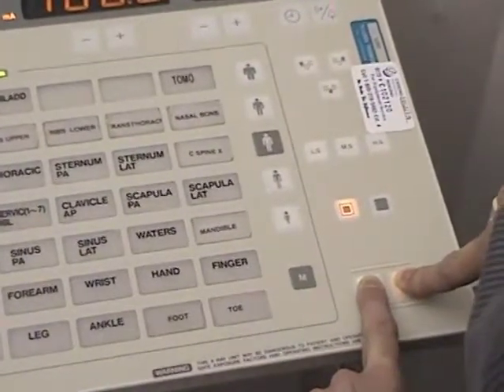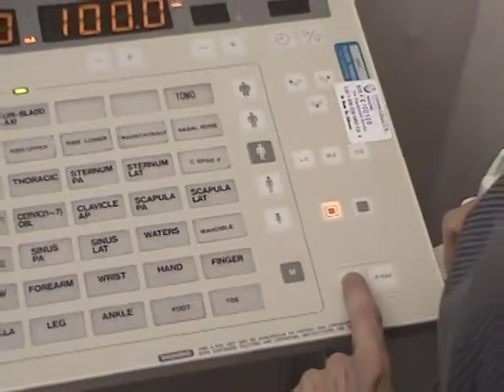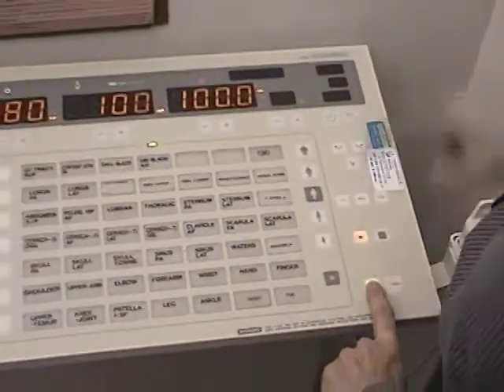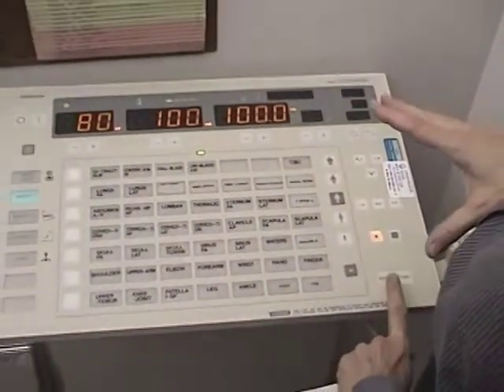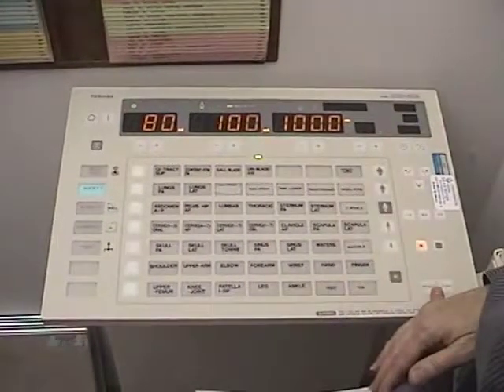The only thing you have to be afraid of is letting your finger up too quickly, because then you can make the exposure too short. If you push ready and you push X-ray and you're afraid of it, as many people are as they begin, you've shortened the exposure and your film will be underexposed.